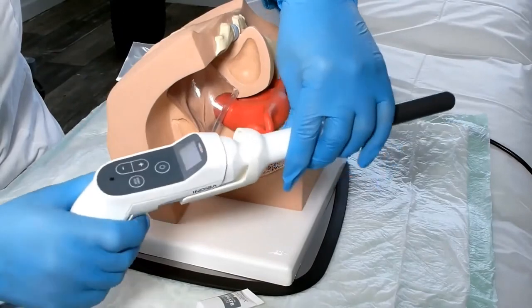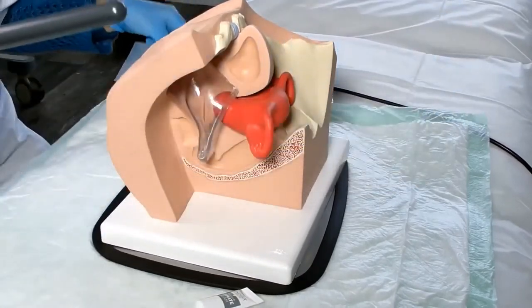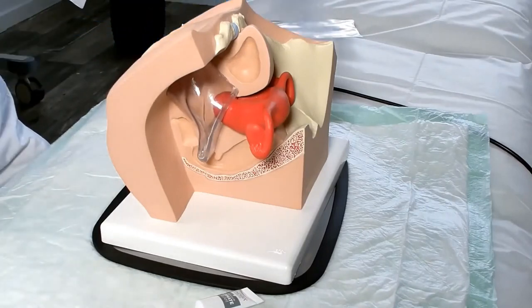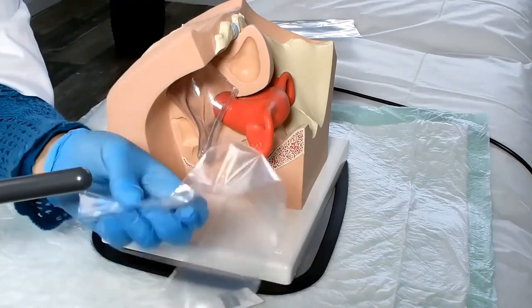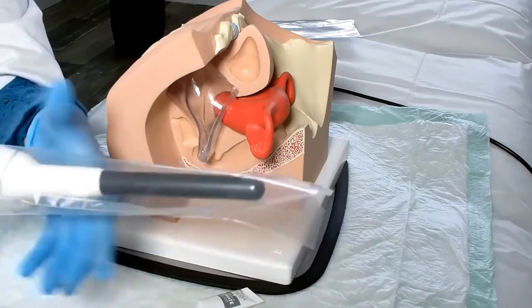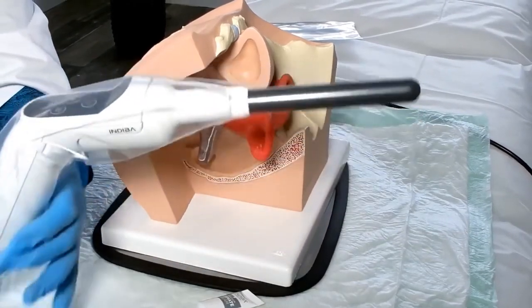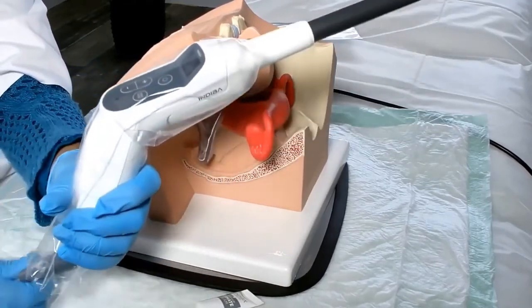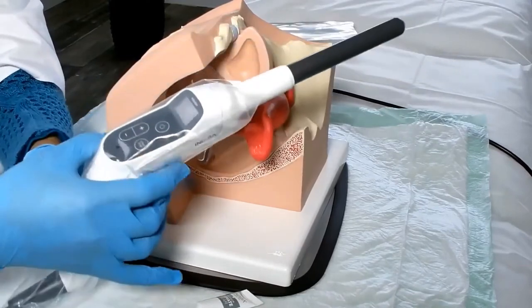Place the disposable electrode at the free end on the intracavity handle and fully insert it until it is secure. Place the plastic disposable cover on the handle and keep the handle covered.